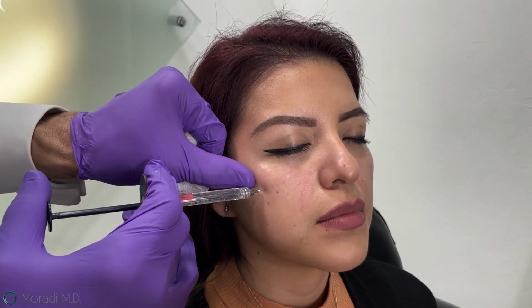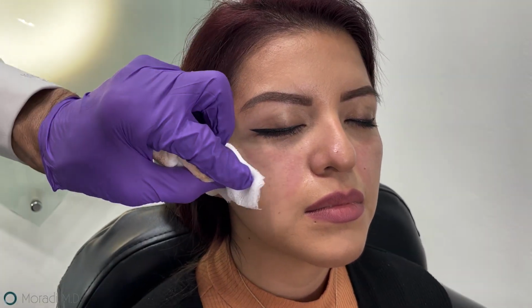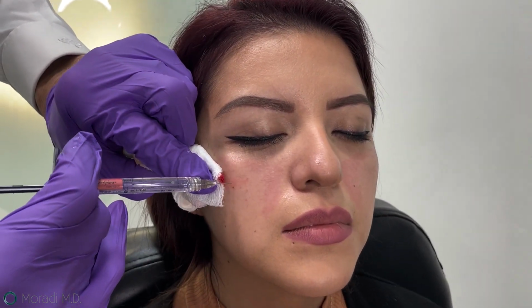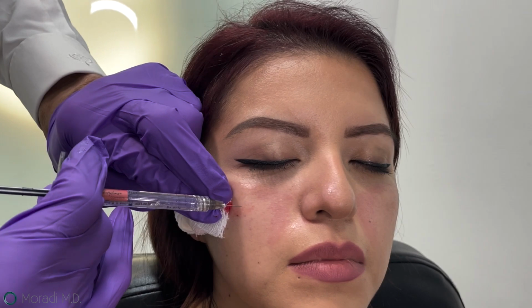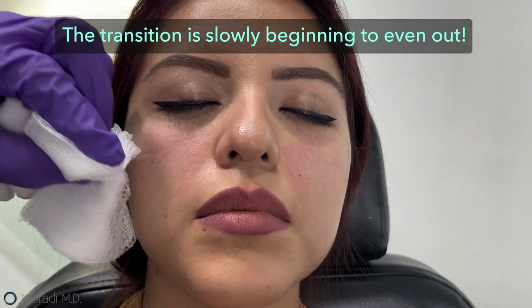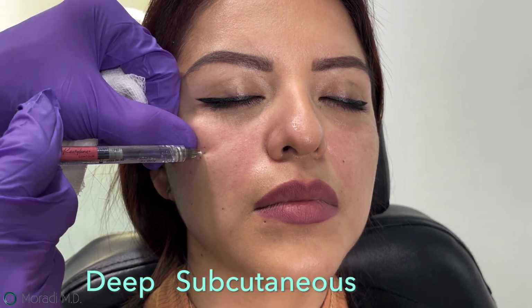I'm sorry. Tell me in case you need any break, okay? Small injection. Less than 0.1 per injection without too much pressure. So slowly we can see we're starting to make that transition a little bit smoother across. The injections are performed in the deep subcutaneous tissue.